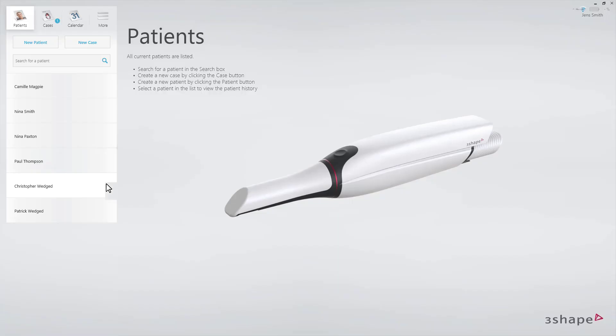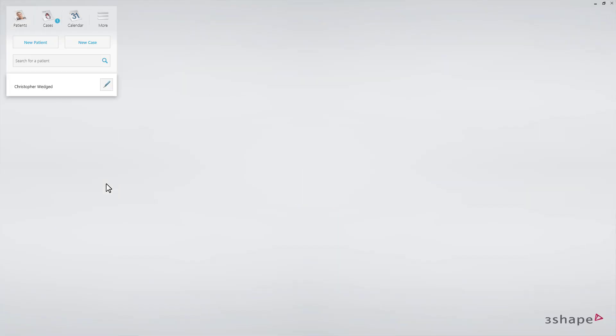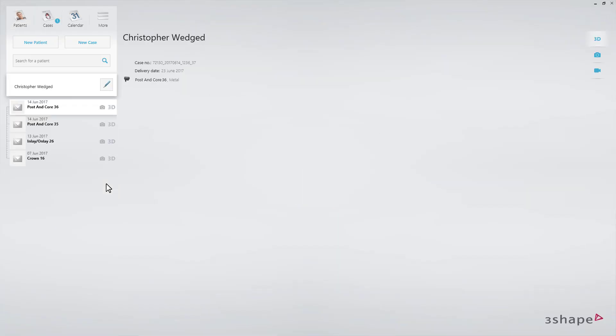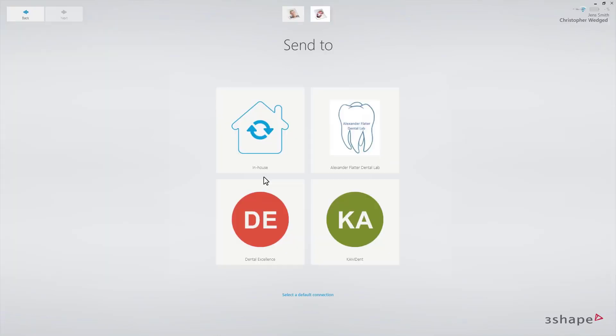Starting on the patient's page, select the patient, then click New Case. The order form will appear. Select the lab. If you only have one lab, this lab is automatically pre-selected.